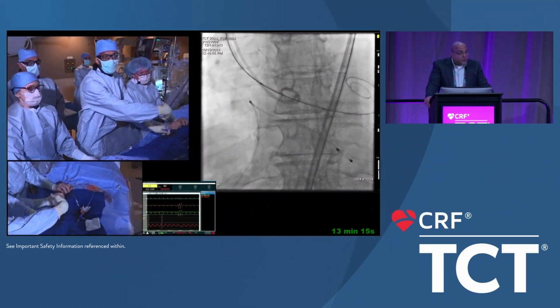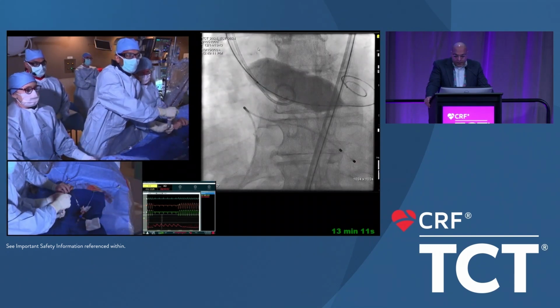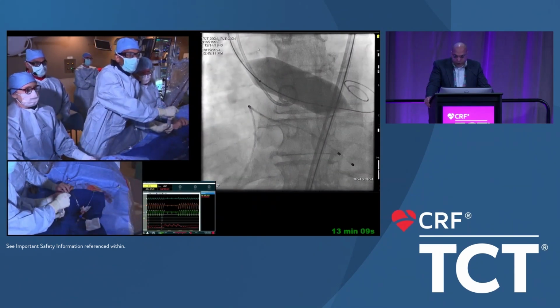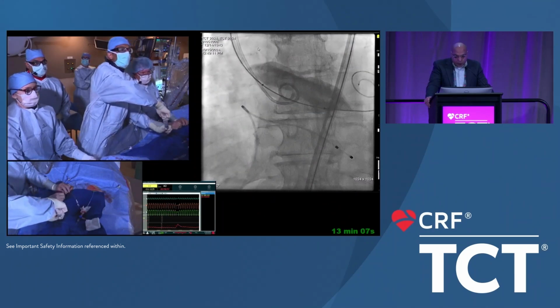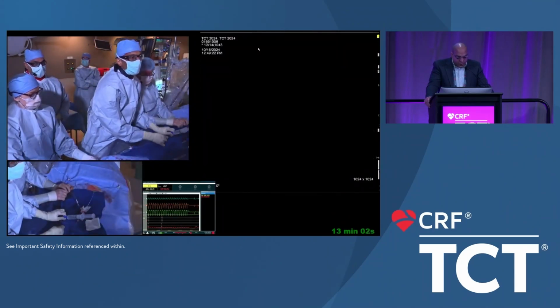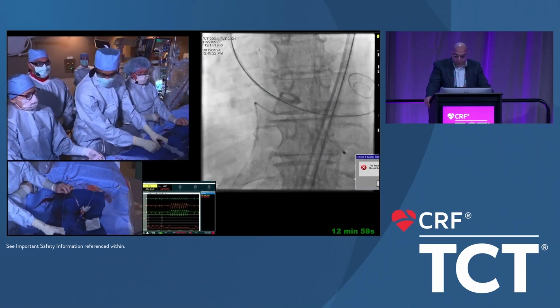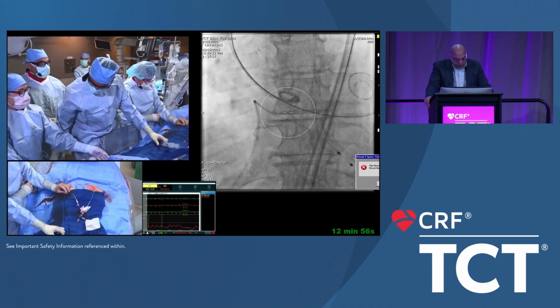We talked about doing this conservative BAV, right? So we've got a 29 millimeter annulus, 29.2 I think it was, and we're just using a 24 millimeter balloon to do a fairly conservative BAV, and then typically we get good expansion with the Navitor after that.